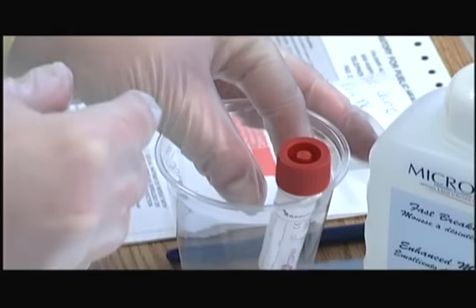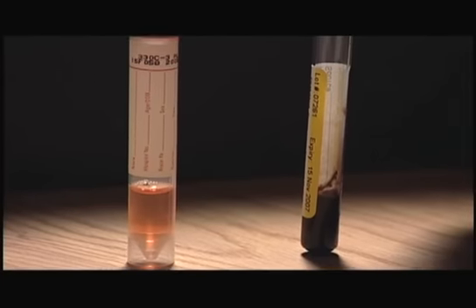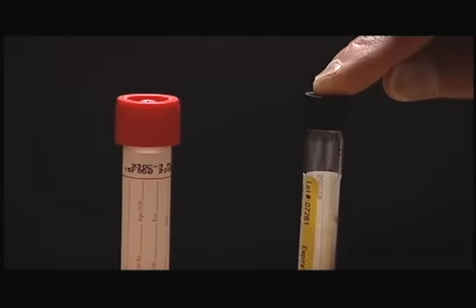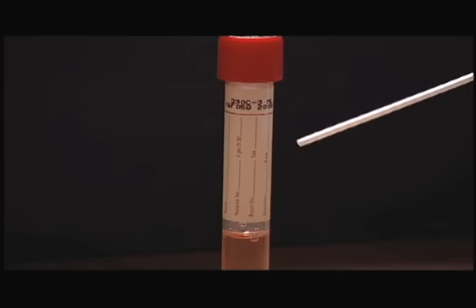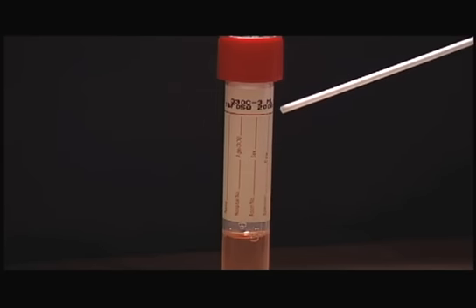This medium is not suitable for pertussis or bacterial pathogens. The medium to the right of the universal transport medium is Regan Lowe medium, which should be used for the collection of pertussis.